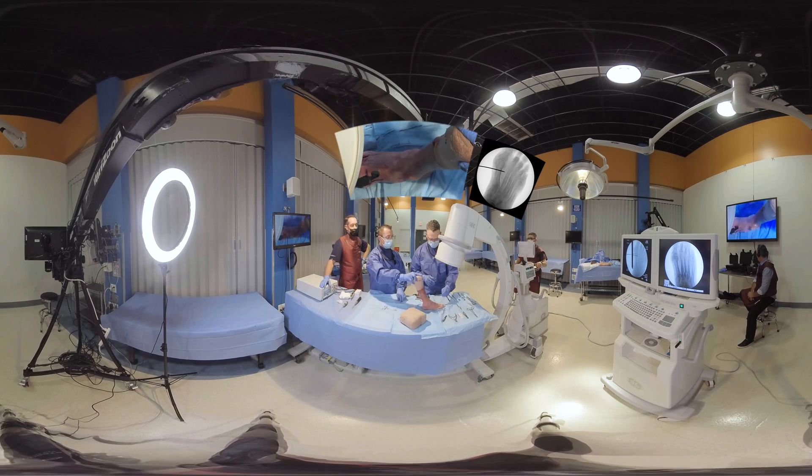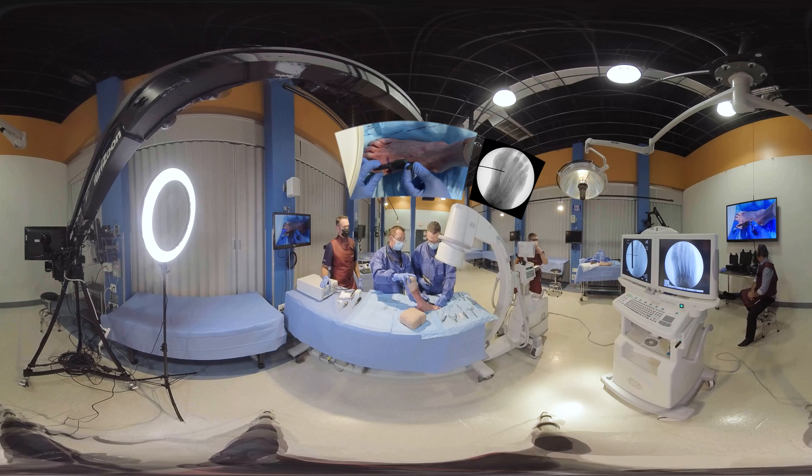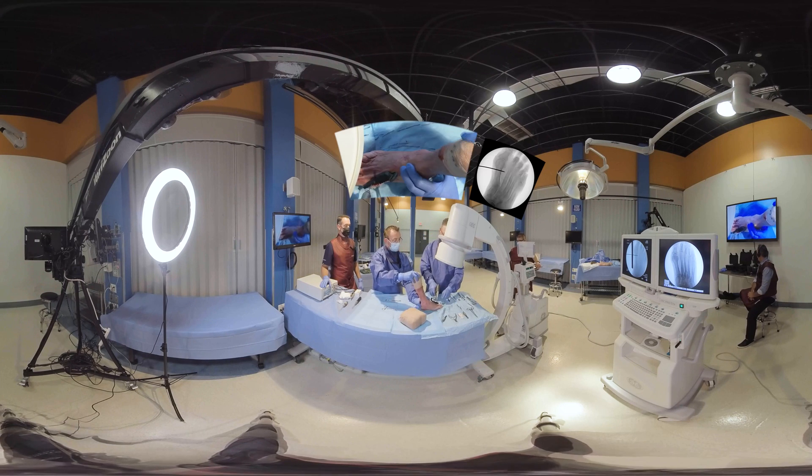Absolutely. So this is a special targeting guide. Your thumb or finger can use it to rotate and angulate the capital fragment. So what we're going to do is mount this device on the distal first metatarsal. The flat aspect of the device goes against both the head and shaft of the first metatarsal. So it looks like you have that slightly internally rotated — is that intentional on the medial side? Exactly, so dorsal medial, so we can get it out of the way of our osteotomy and our incision.